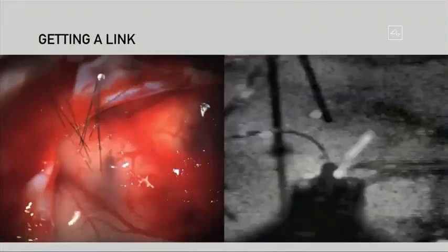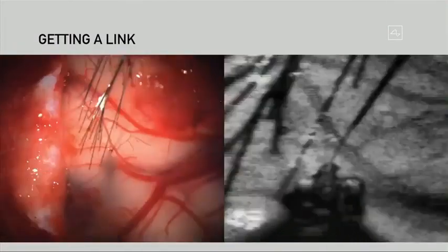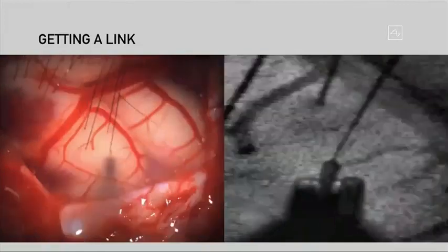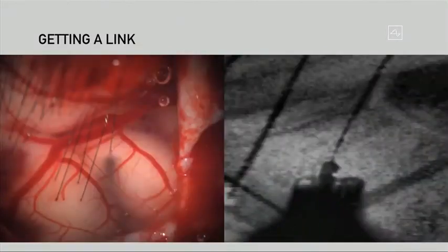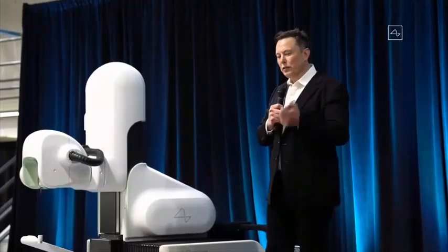This shows a close-up view, which I think is not too gruesome, of the electrodes being inserted in the brain. If you look closely, it's a little counterintuitive, but if the electrodes are inserted very carefully, there's no bleeding. If you have very tiny electrodes, and the robot images the brain and makes sure to avoid any veins or arteries, the electrodes can be inserted with no noticeable damage. So you will have no noticeable neural damage in inserting the Link. You might think if you stab something with a wire, surely it will bleed, but at a really small scale, it does not.